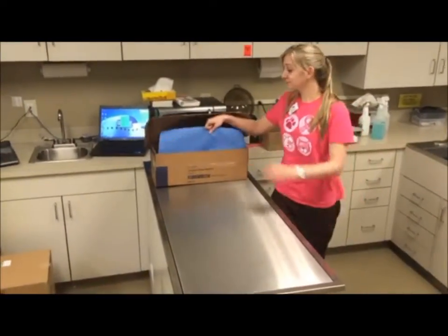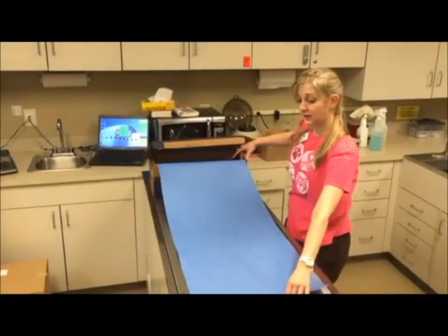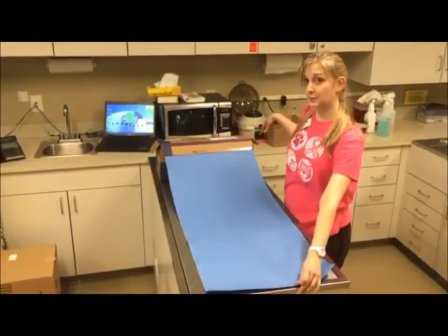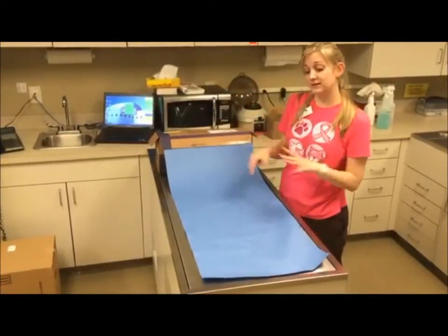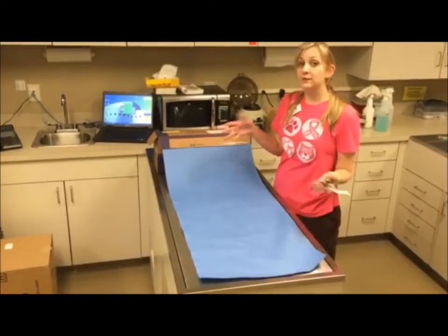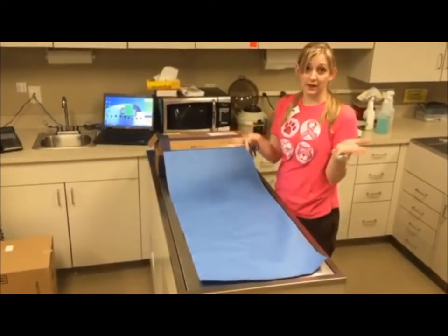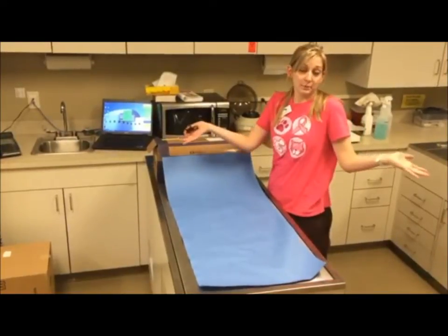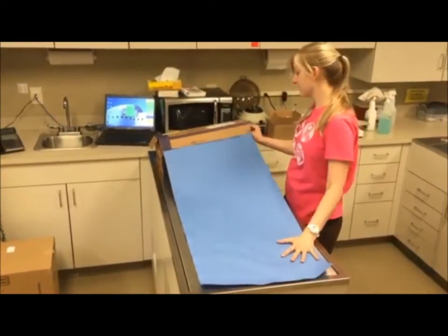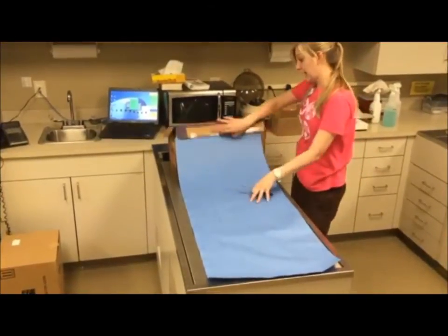Now, how to fold and cut drapes. The rule of thumb is you typically want the drape to cover the entire length of the dental table. You want to visualize in your mind that it's going to cover a large dog and a small dog. If it's too big, the doctor can always cut it to size in the surgery suite, so you want to make sure it's big enough to cover the entire animal. If it's like a hundred pound dog, you want to make sure it's fully covered — I usually use the length of the dental table as my guide.